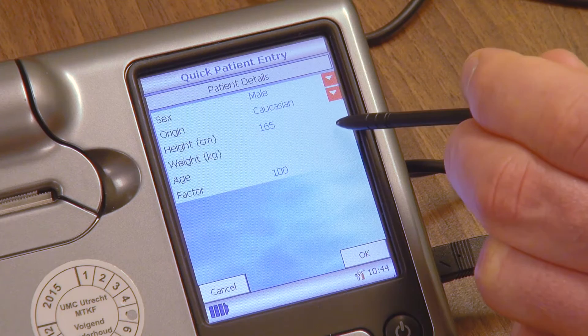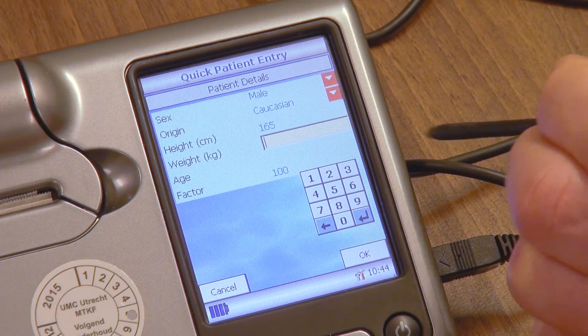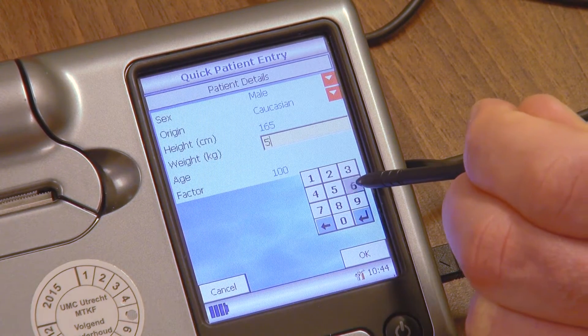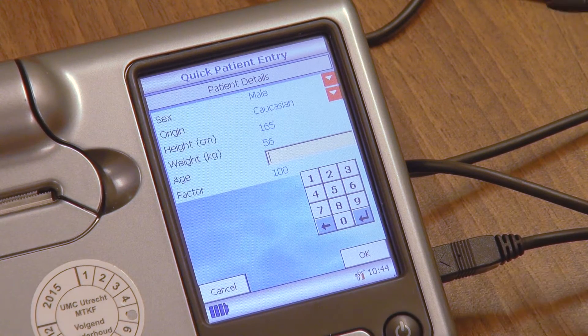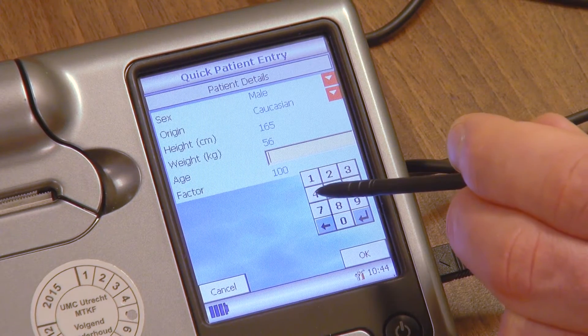Report the patient's weight by filling in the weight. Units, again, are country specific. Report the patient's age by filling in the age in years.